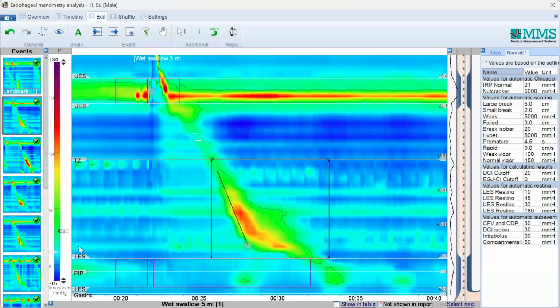We have water perfusion and we have solid state, so it is not the same normal values. One of them was 15 and one was 20. Then in the last classification they decided to consider it 20. So if the IRP is abnormal, let's say 25, 30, okay?